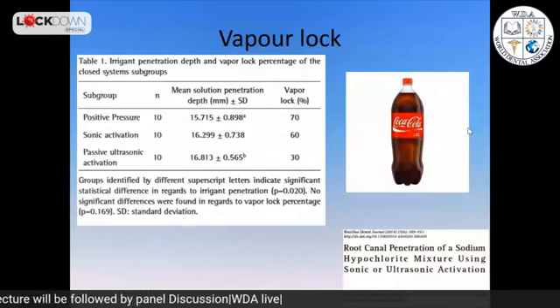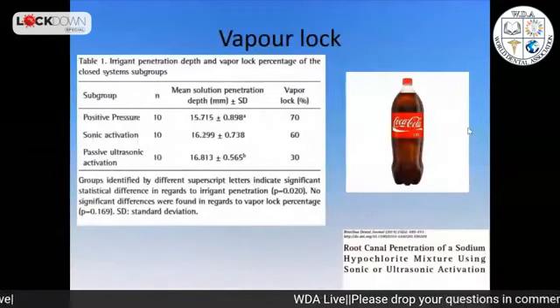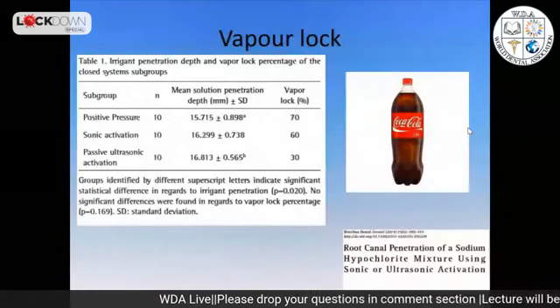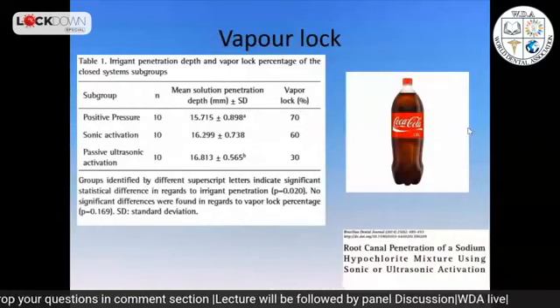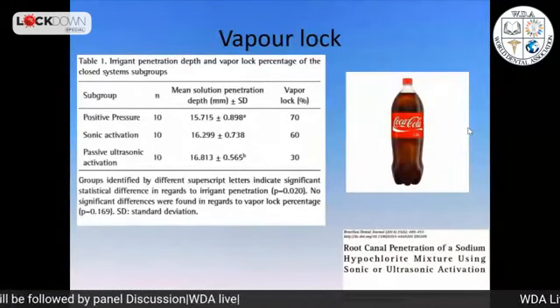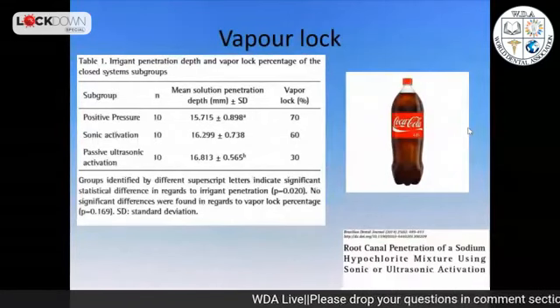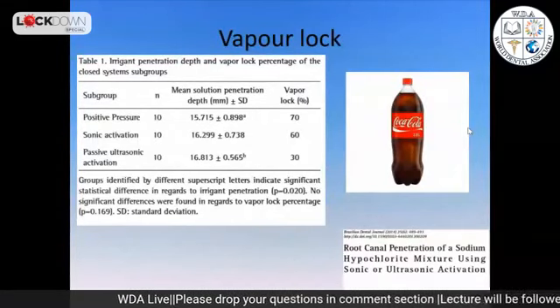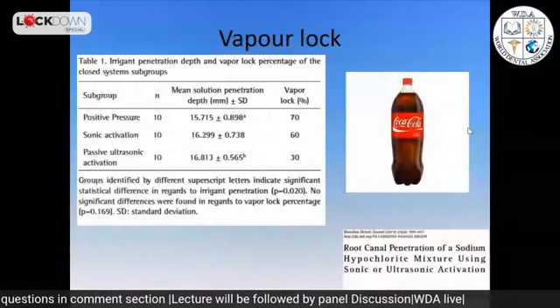Now, you normally see this sodium hypochlorite inside the root canal is always making bubbles. There is already air there, and we make more bubbles. So what happens? We need to move, displace, break down, do something with these bubbles. Those bubbles are preventing our chemicals from touching the root canal walls, and they are also preventing the chemicals from going to the length that we desire.